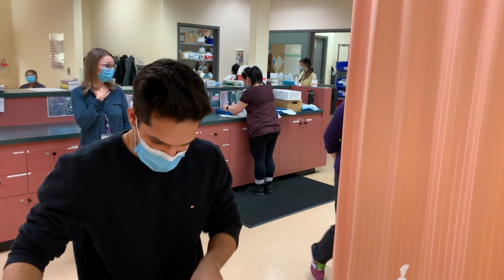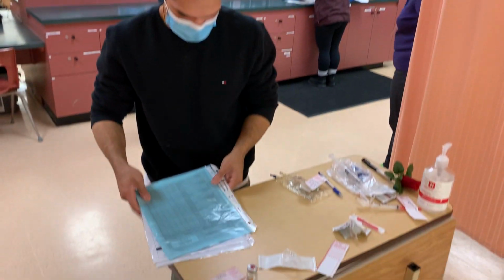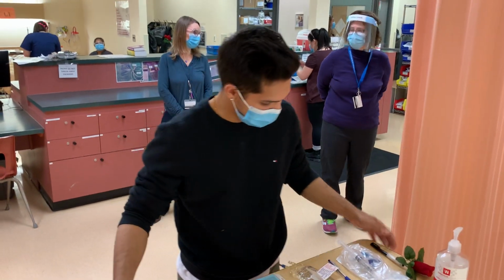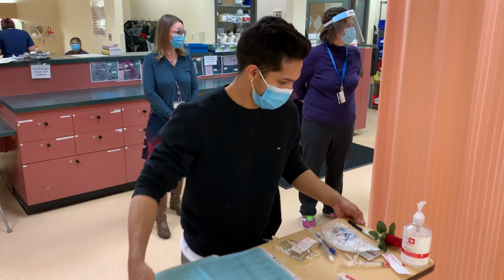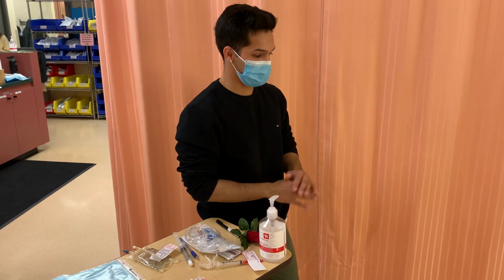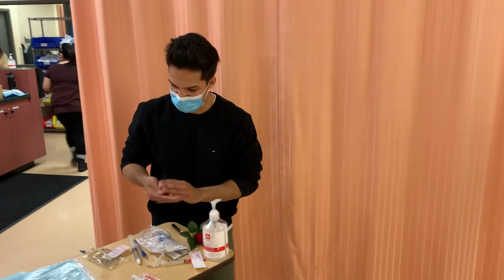With all my supplies, I mainly just need my MAR. Okay, so I'll be heading to my patient's room now. Upon entering the patient's room, I'll be doing my entry safety check, making sure call bells are within reach, the patient shows no signs of distress, there are no tripping hazards, and the bed is at the lowest position possible. Once I've done that, I'm just going to introduce myself to the patient.